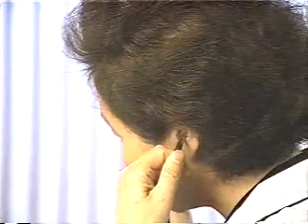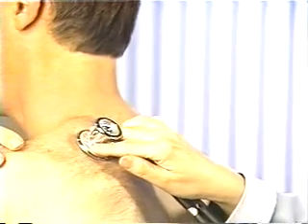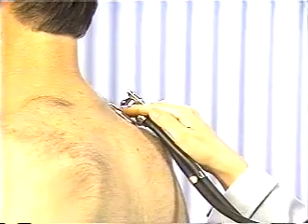During auscultation, have the patient breathe deeply through his mouth. If the patient becomes uncomfortable, allow a rest period.